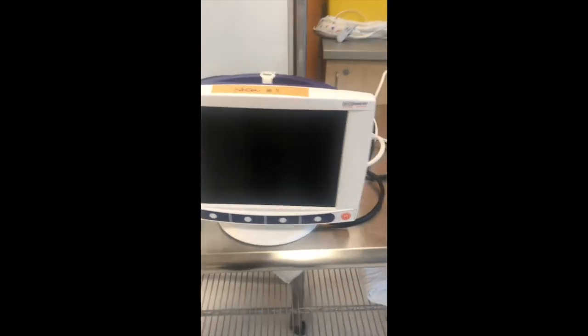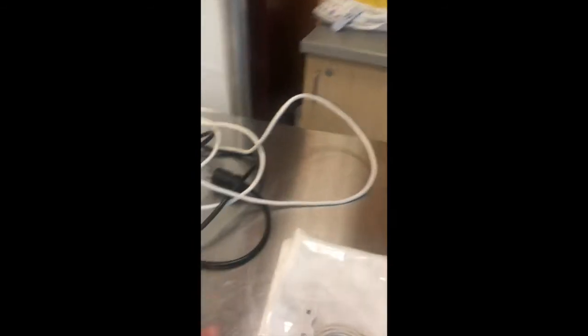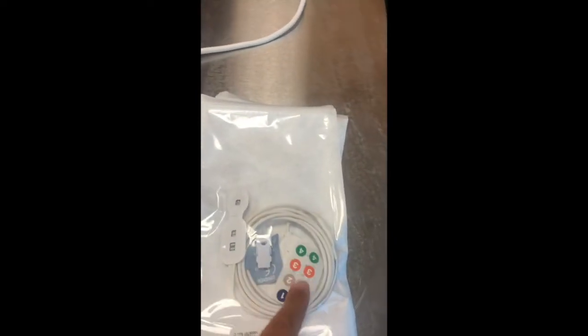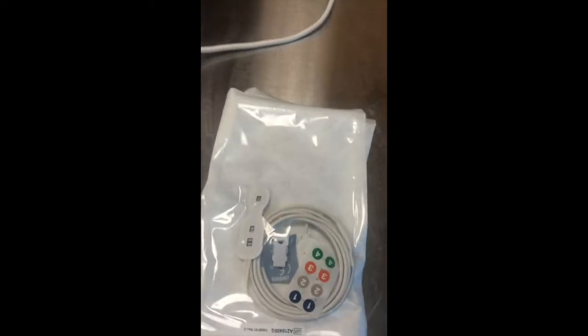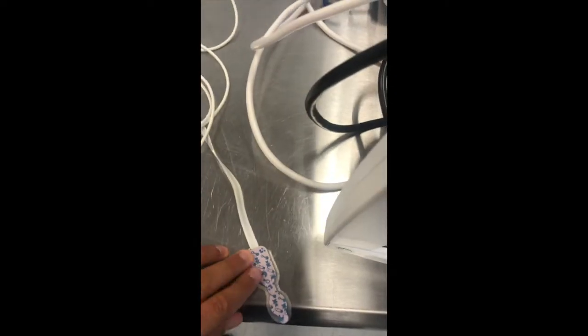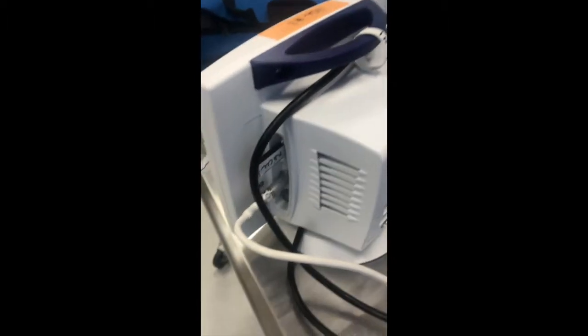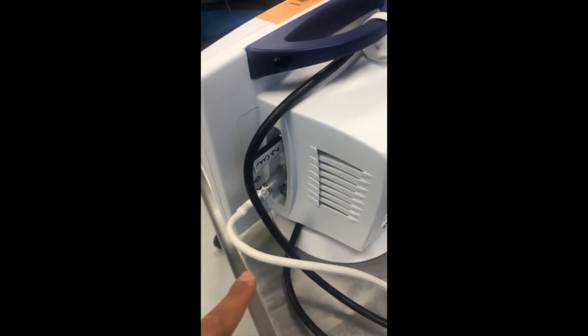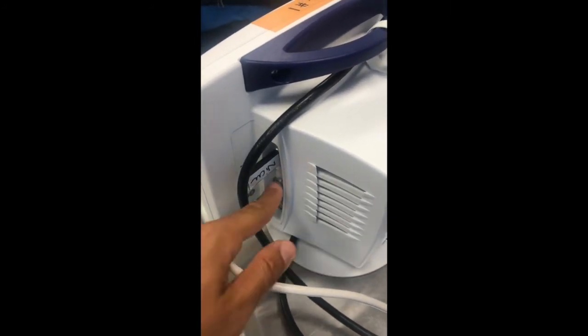For the placement of the NIRS monitor, you need the monitor plugged, and your sensors which come in a package. There's a sticker on top, and they have numbers to identify them easily. Typically, we put sticker number one on the sensor and also number one on the connector, so we know it connects to port number one whenever we have to unplug or re-plug. There is also a USB key that allows us to record the raw signal of the patient during monitoring.